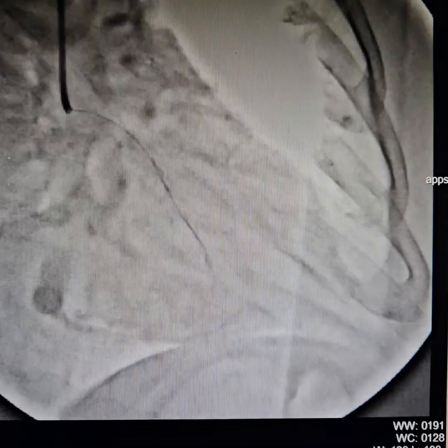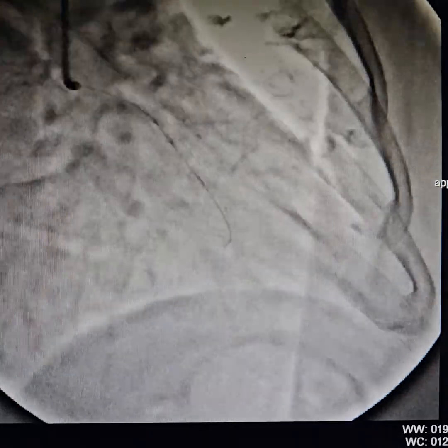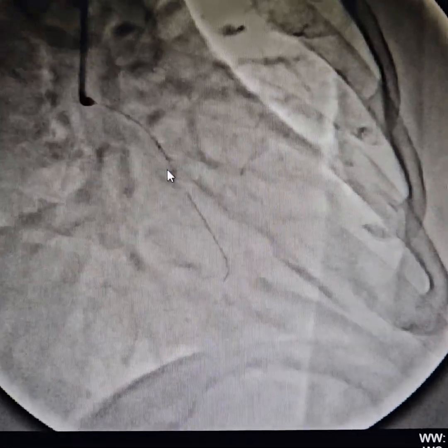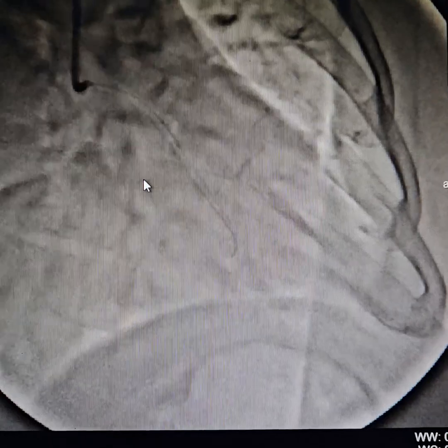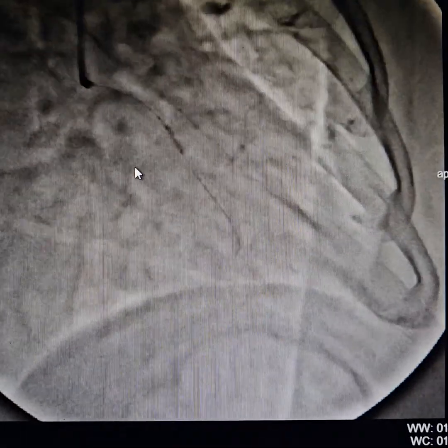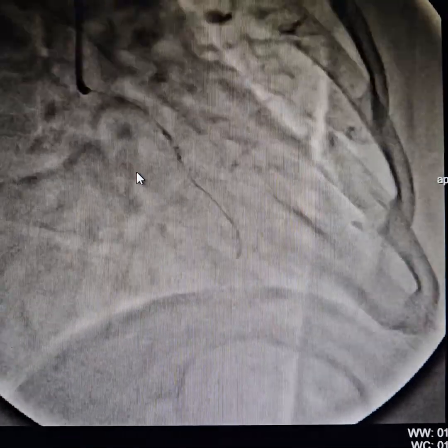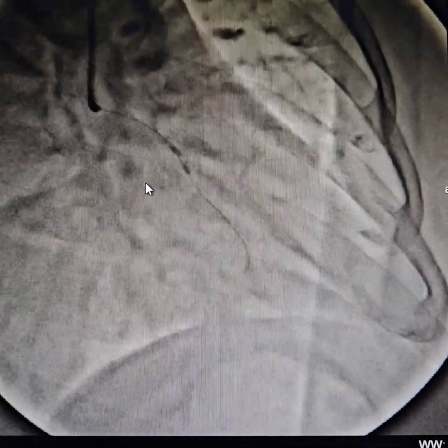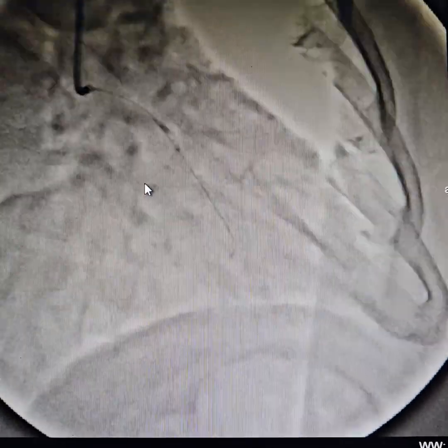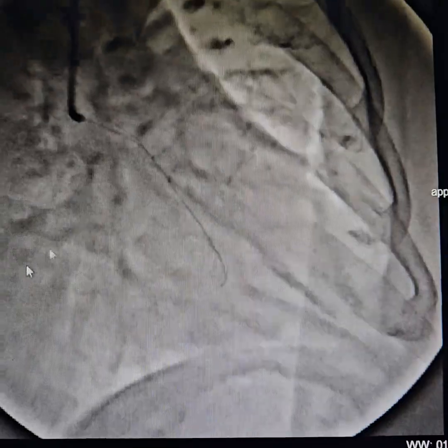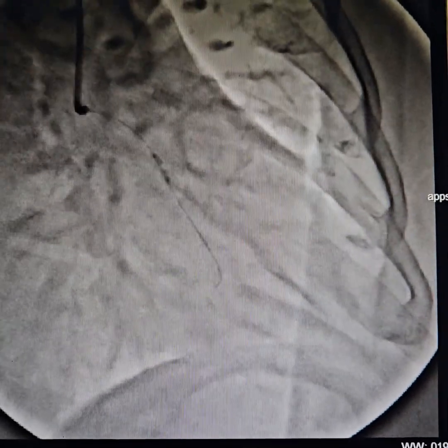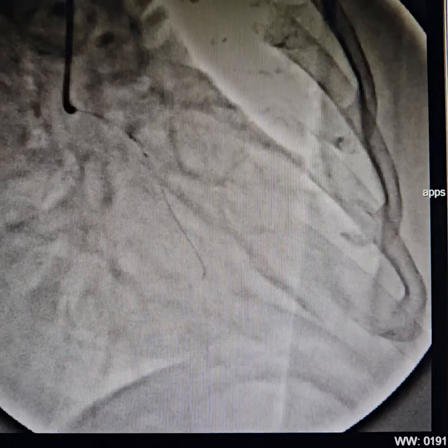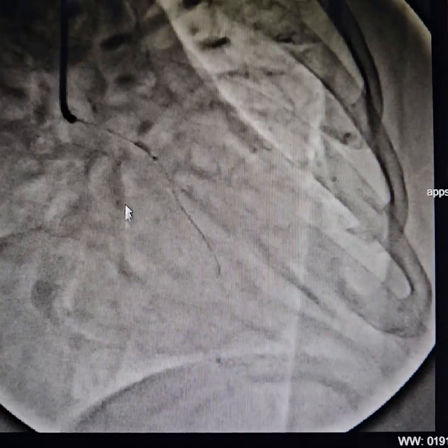Next, what we did was pre-dilate the lesion. Lesion preparation is very important. In lesion preparation, you have to try and achieve at least less than 30 to 40 percent stenosis.